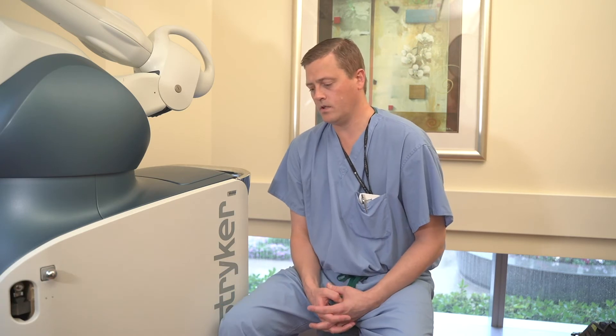One of the benefits of using the Mako robot for total knees is we're able to make precise bone cuts and alter the outside, the inside, and the top of the back of the knee specifically without affecting the other side. With a traditional knee, we put on a standardized cutting block and use that same block for every patient — in different sizes, but we're taking off the same amount from the inside and the outside.